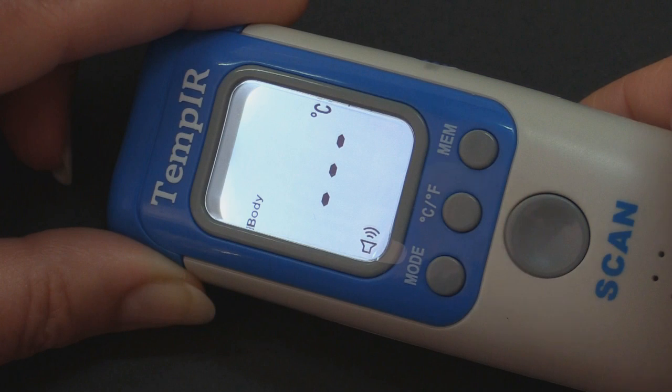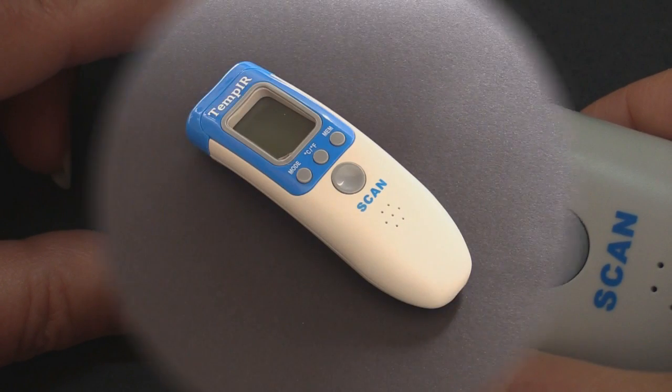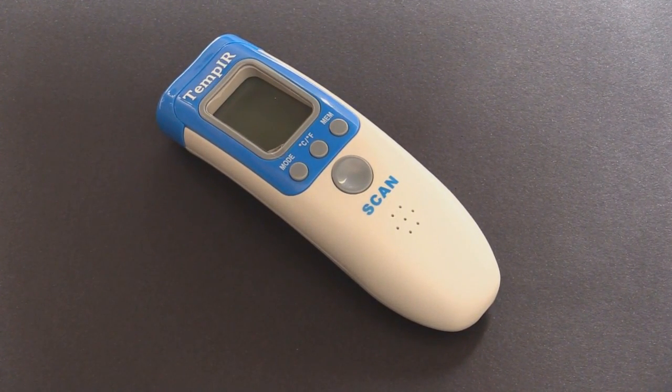To take the temperature of a room, use the mode button to select room. It is important that the thermometer is allowed to acclimatise in the room for about 15 minutes.